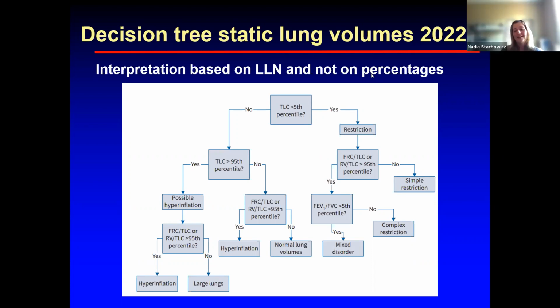Yeah, it's a great question, and I know it comes up a lot on any webinars that I've been on, and even in my own lab, we used to struggle, especially when you're seeing people who are on chemotherapies. You know, you're always thinking, how far back should I go with one of these? We always then in these cases do it on the same day of the measurement.